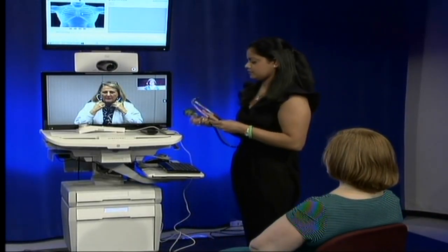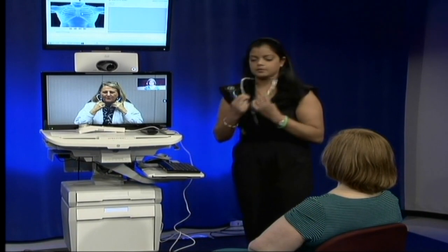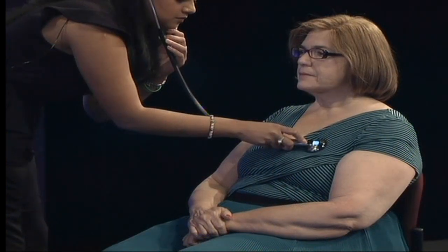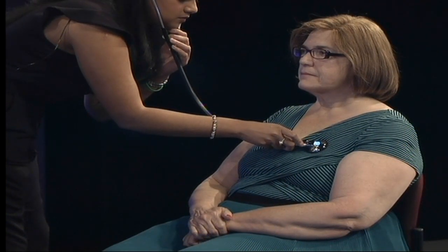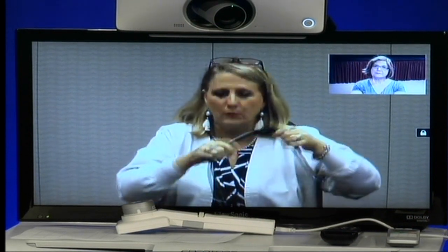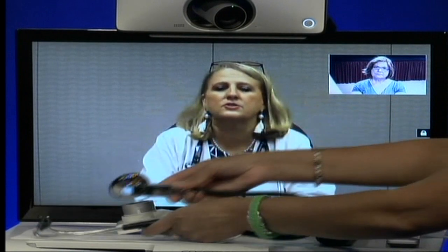Okay, that sounds really good. Let me listen to your heart. Okay. Now let me take a peek at the area you are concerned about.